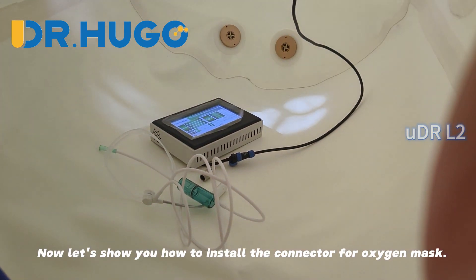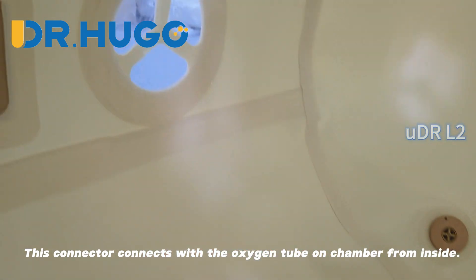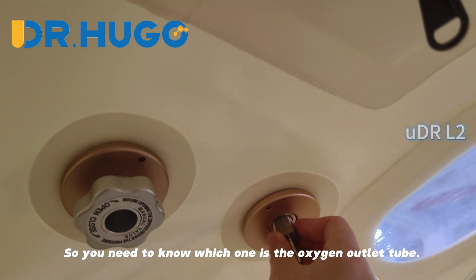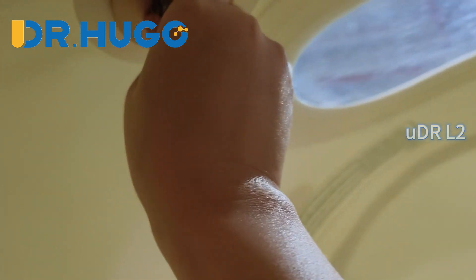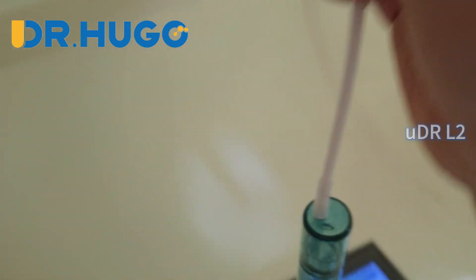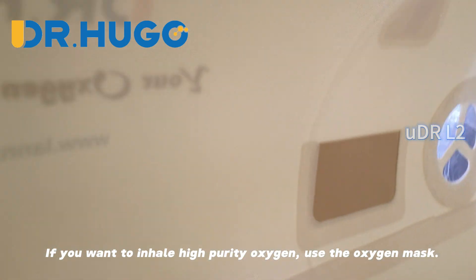Now let's show you how to install the connector for the oxygen mask. This connector connects with the oxygen tube on the chamber from inside, so you need to identify which one is the oxygen outlet. Just screw this connector in from inside the chamber, then reconnect the oxygen mask by plugging it in. If you want to inhale high purity oxygen, use the oxygen mask.